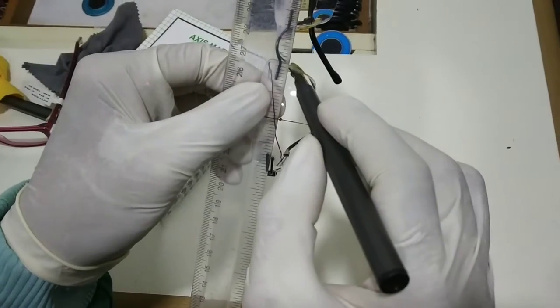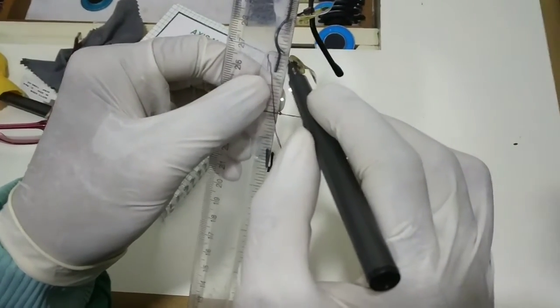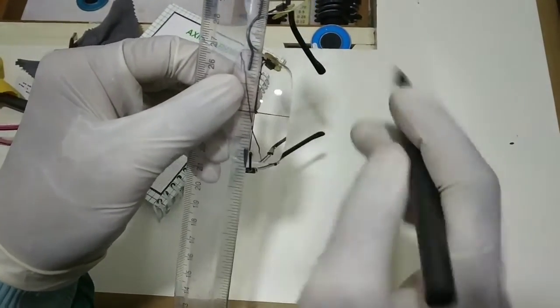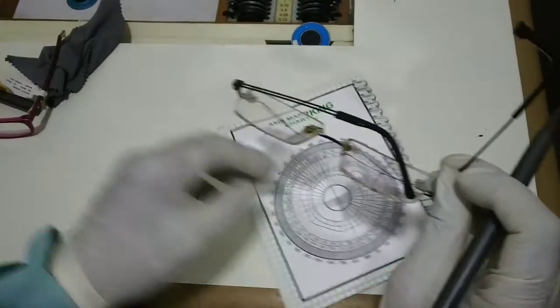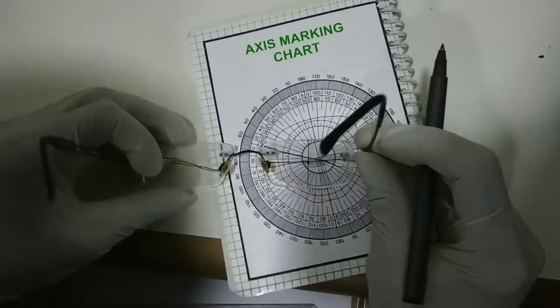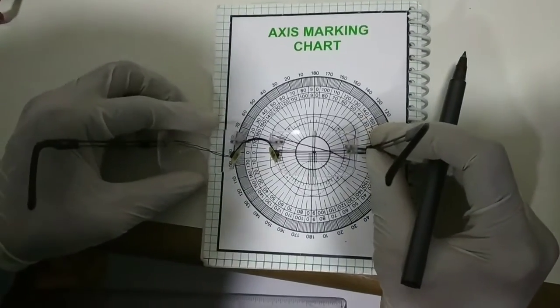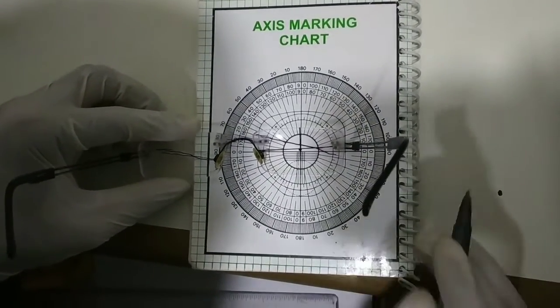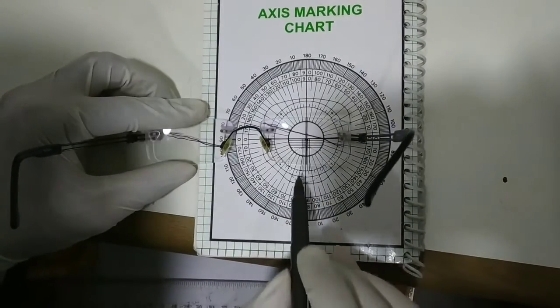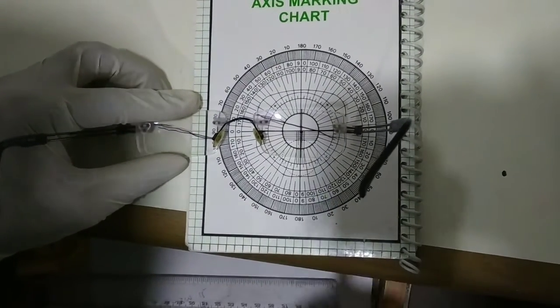We have to align it properly and make vertical and horizontal lines. The centration is the dot center which you can see. Now we have to use the axis marking chart with the vertical and horizontal lines inside, which I have aligned properly.